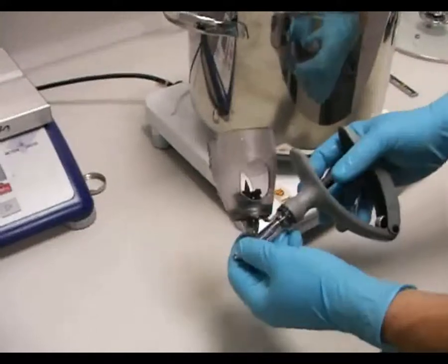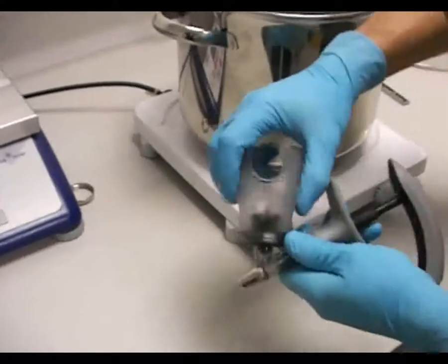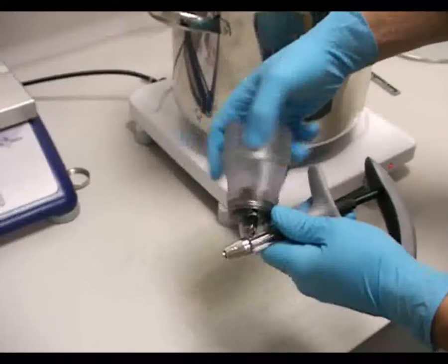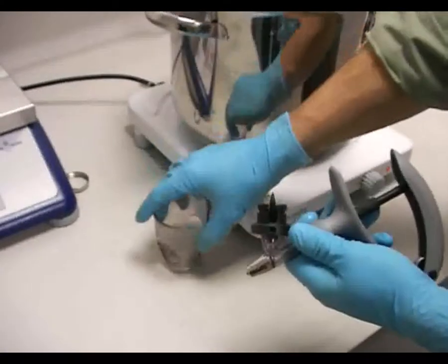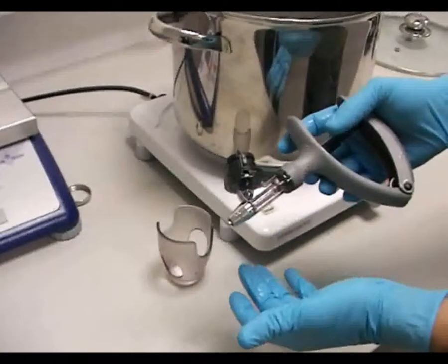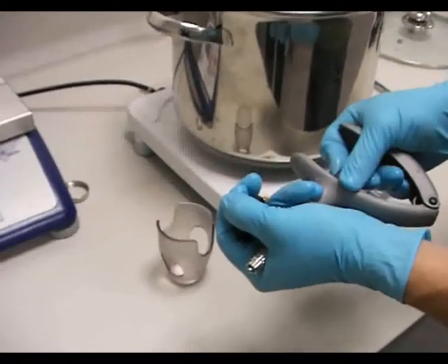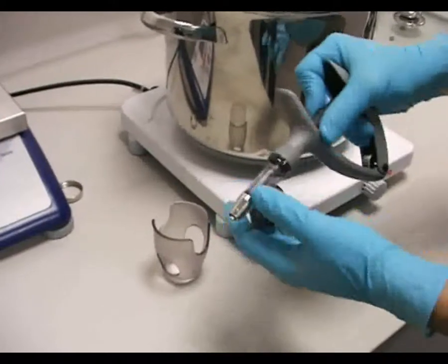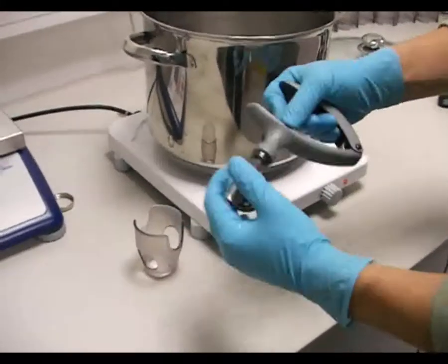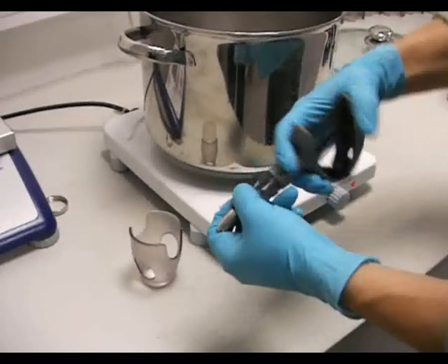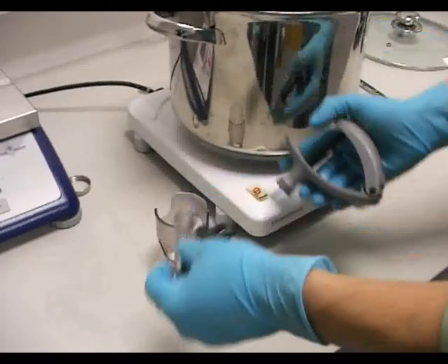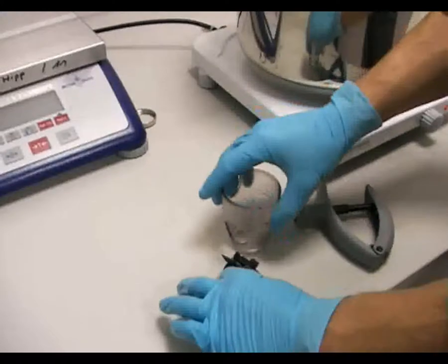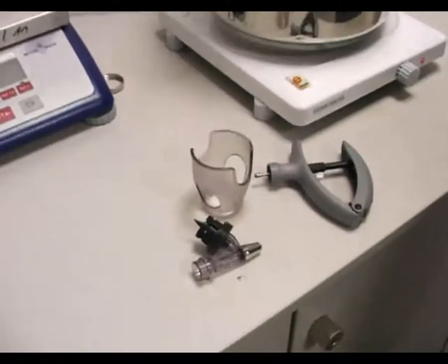Die Spritze kann wie folgt demontiert werden. Arbeitsgang 1: Man schraubt den Korb vom Flaschenhalter durch eine Linksdrehung ab. Gleichermaßen kann der Zylinder mit Metallkanülenansatz vom Griff durch eine Linksdrehung abgeschraubt werden. Die Spritze ist nun in ihre gesamten drei Teile zerlegt.